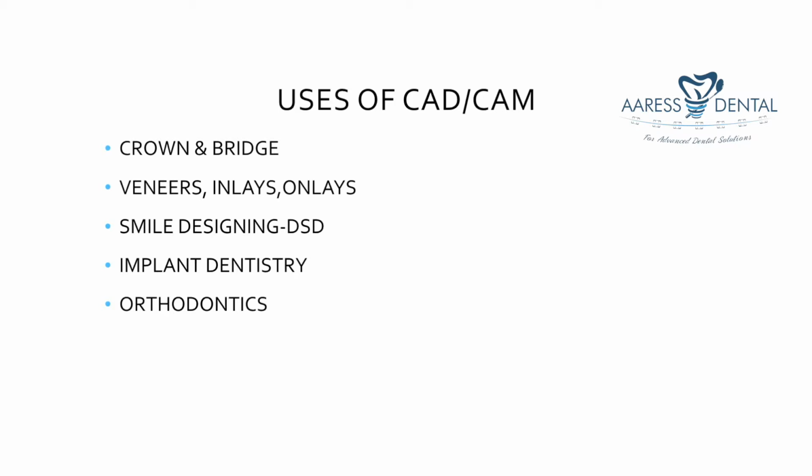Where all can we use CAD/CAM? It is used in crown and bridge. We can use it in veneers, inlays, onlays. We can use it in smile designing, the digital smile designing cases. It is used in implant dentistry and it can also be used in orthodontics.